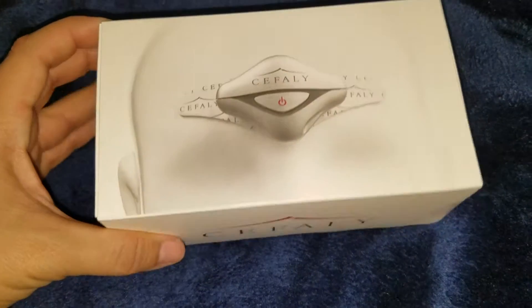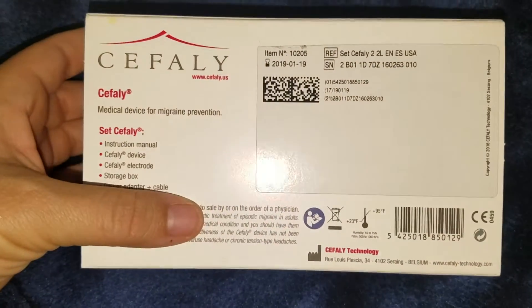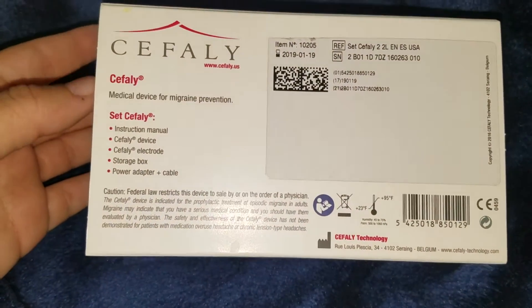So when you first get the device, it comes all in this box, and the box will tell you what's inside of it, so make sure everything that it says here is actually inside the box. If you're missing anything, contact the company that you bought it from.